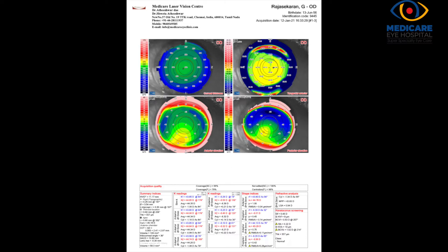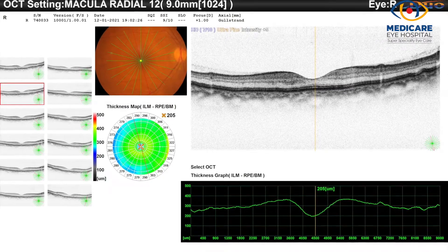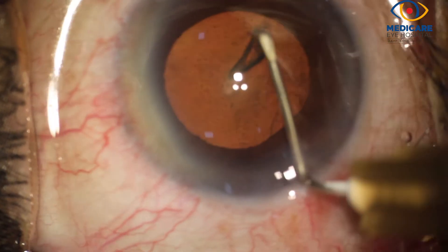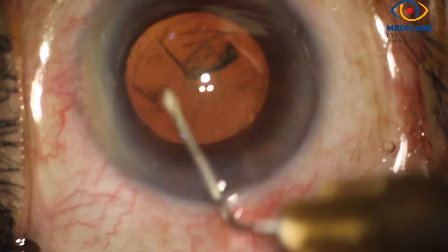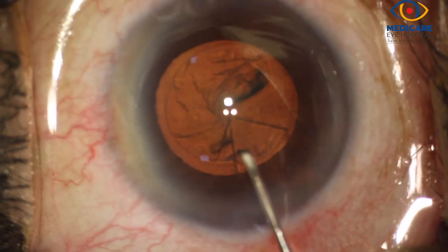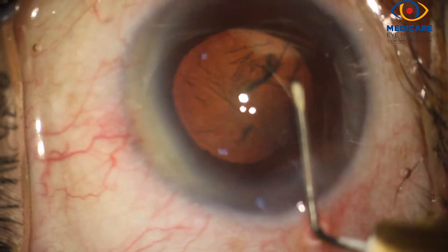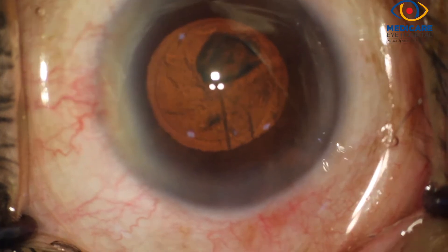Preoperatively, corneal topography and spectral domain OCT are always performed before implanting trifocal intraocular lenses. After deepening the anterior chamber with viscoelastic, an anterior continuous curvilinear capsulorhexis is performed using a bent 26-gauge cystotome. You can appreciate the distinct red glow because of the stereo coaxial illumination of the microscope.